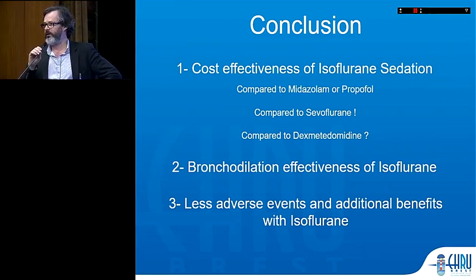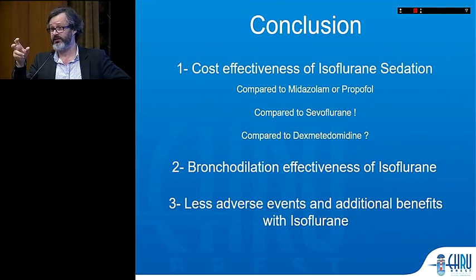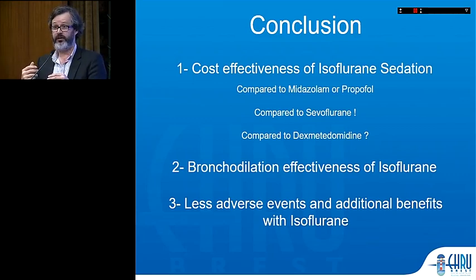This issue has been monitored by Peter Sake in one of his previous studies. The Anaconda by itself scavenges almost 90% of the gases, and the other 10% are scavenged by our charcoal filter. And the external pollution is very low. And I have some more to add. In the ICU, we always monitor the pressure inside the cuff, so we decrease the leaks a lot. And in the study by Peter Sake, he proved that the environmental pollution was very low and quite null.